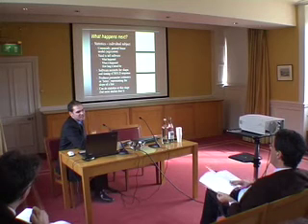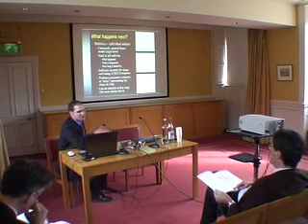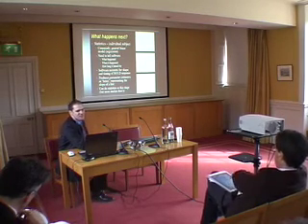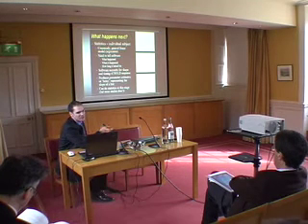And all we need to do is tell our software what happened: what kind of trial, was it an easy trial or a hard trial the subject was doing, and at what point in the scan sequence that happened, which of these images we're going to be particularly interested in, and how long it lasted for. And normally, that's what we tell the software, and the software does the rest.